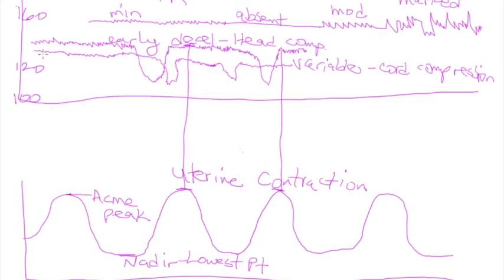So we're talking about deceleration. Accelerations are okay. We have some, that's going to be marked in green. So we have variability here. And goes up, comes back down, up, down, up, down. All right. Accelerations are okay. It's normal.